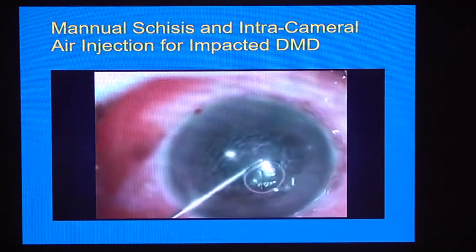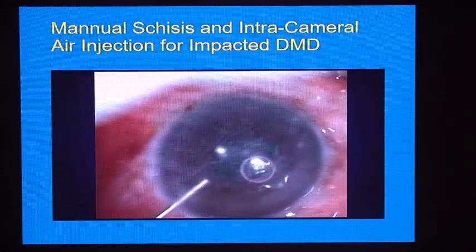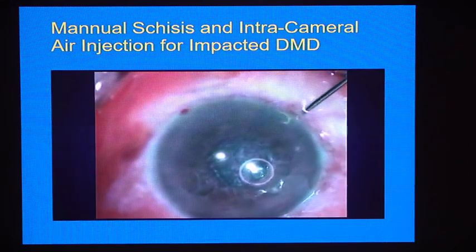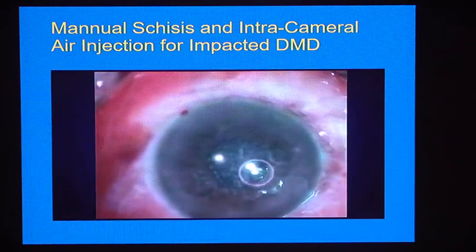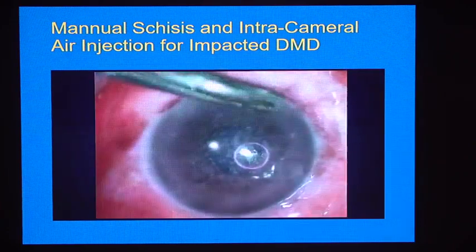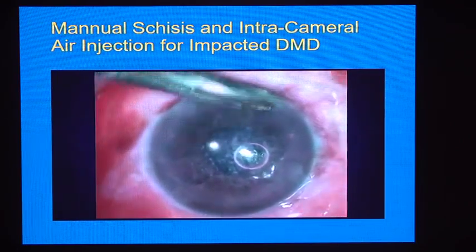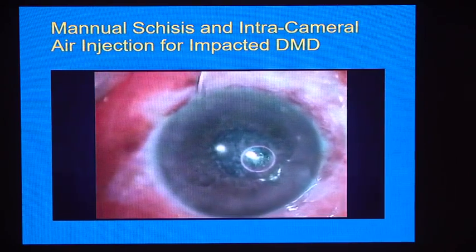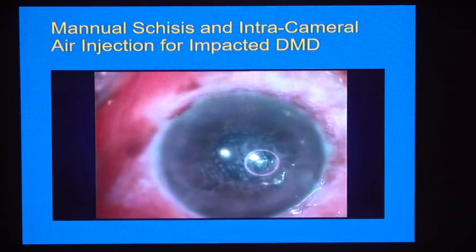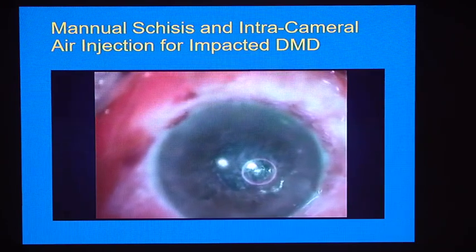So the idea struck that we should bend the cannula and try to disengage the Descemet's membrane from its strictly stuck area. As you can see, the Descemet's membrane detachment is still there. So for that we made the superior paracentesis, and through that we just pulled the Descemet's membrane detachment, because the Descemet's membrane has detached. So once we were putting the tip of the cannula on the Descemet's membrane, it was just the stromal surface, not the endothelial side.